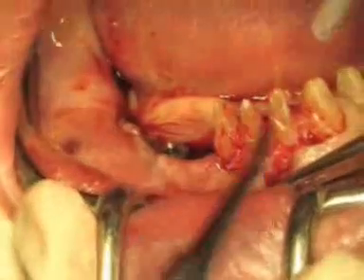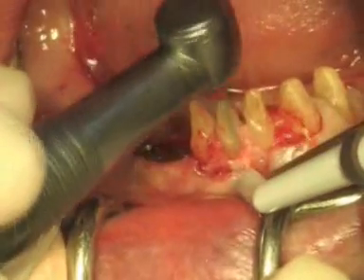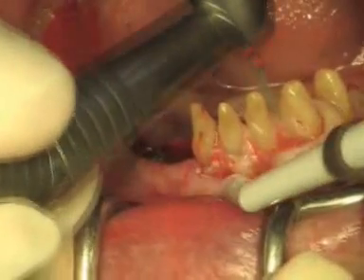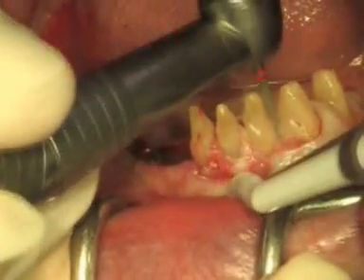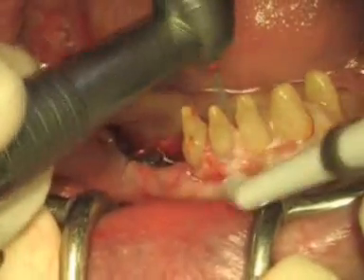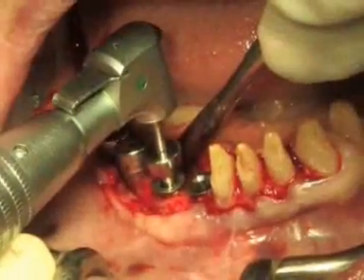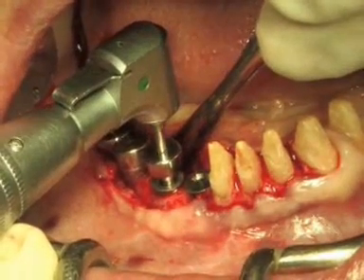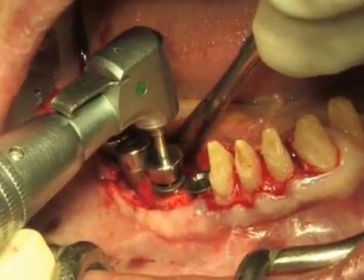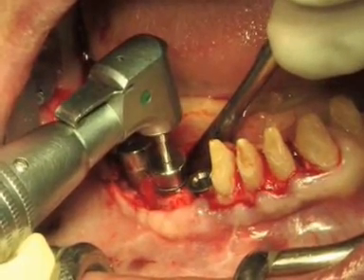Penetrating apically at the alveolar mucus level, the periosteum is anchored, exiting in the dead space, re-entering the papilla a few millimetres more apically with respect to the necks of the newly designed papillae, passing lingually, catching the lingual flap, and then returning vestibularly after having engaged the lingual flap with a horizontal mattress suture. Returning vestibularly to make a knot. The periosteal anchorage, which was carried out initially at the vestibular level, with this closure, will give the flap apical stabilization with respect to the bone ridge.